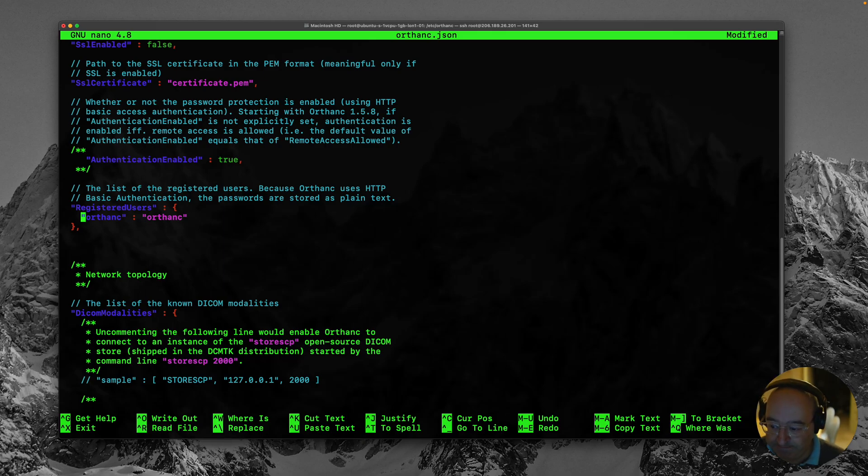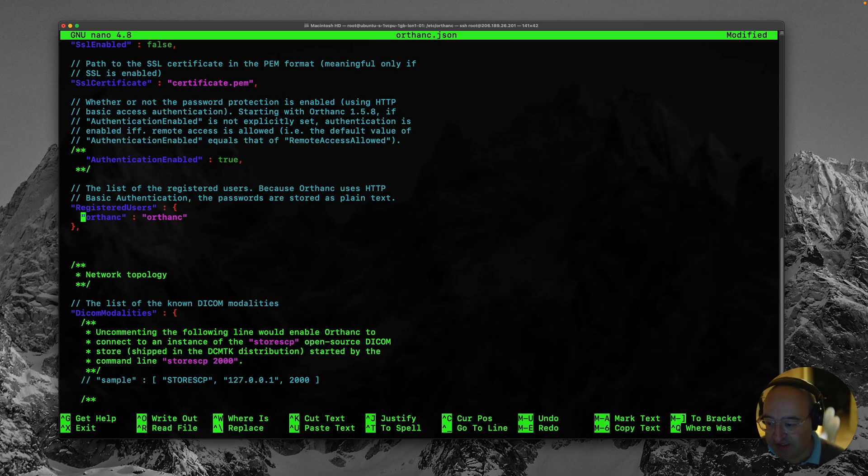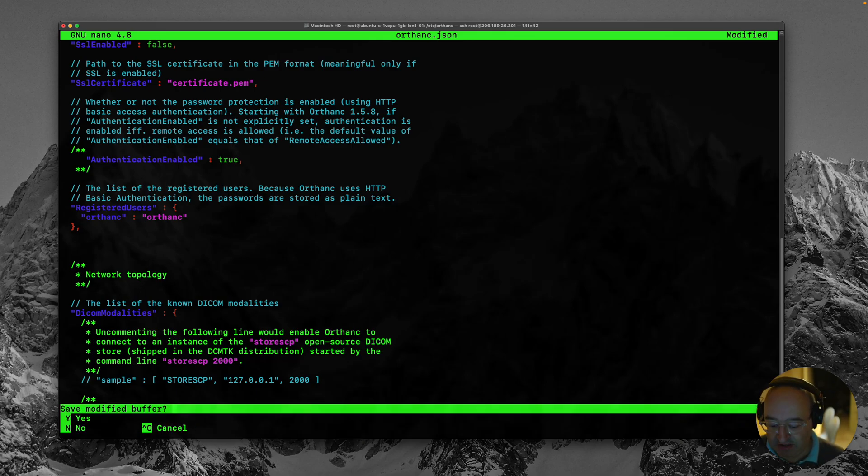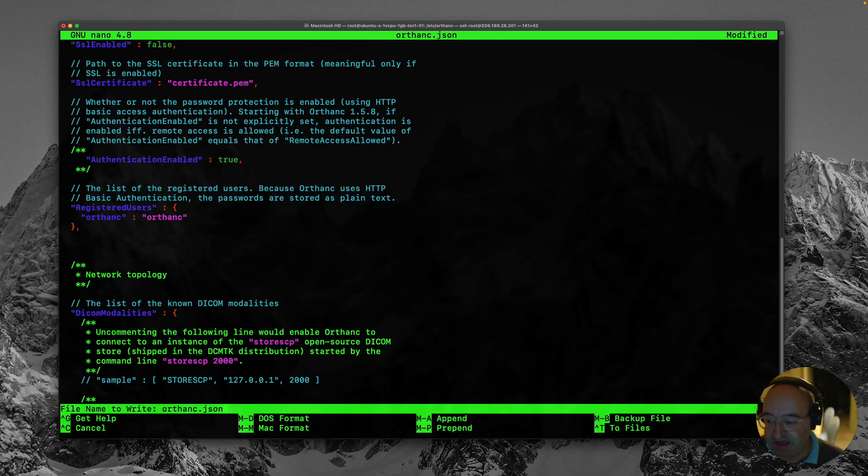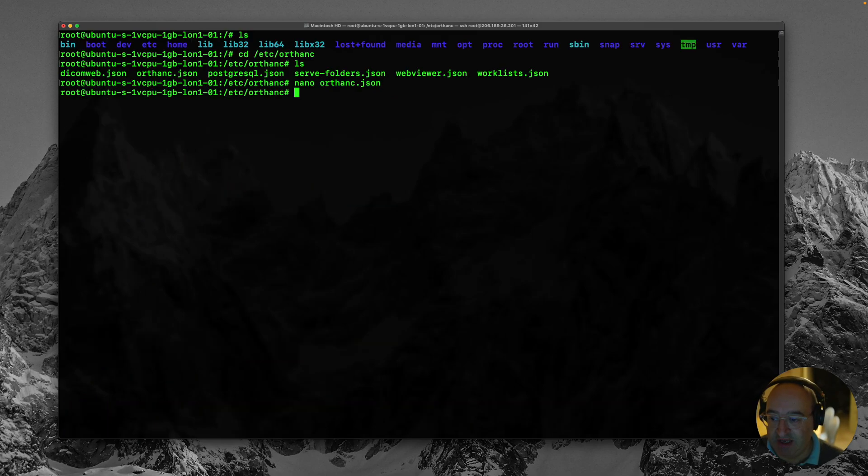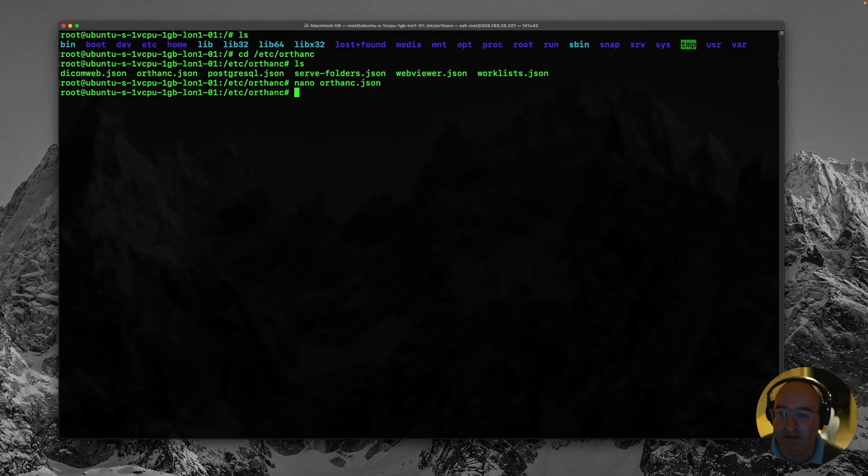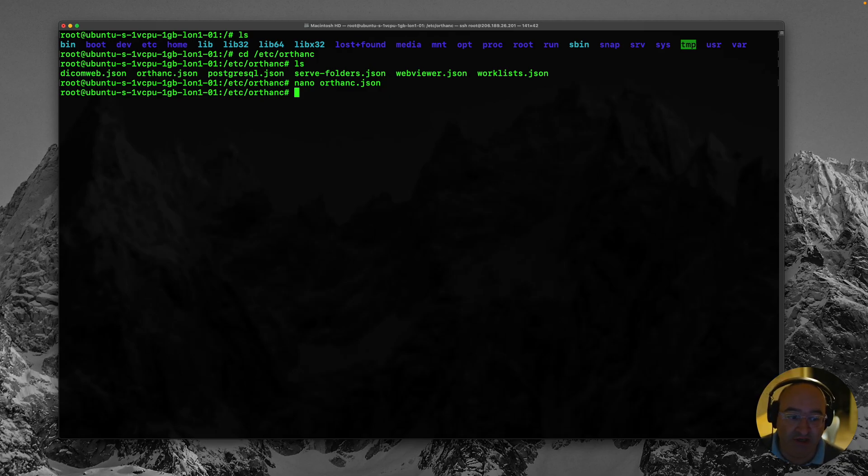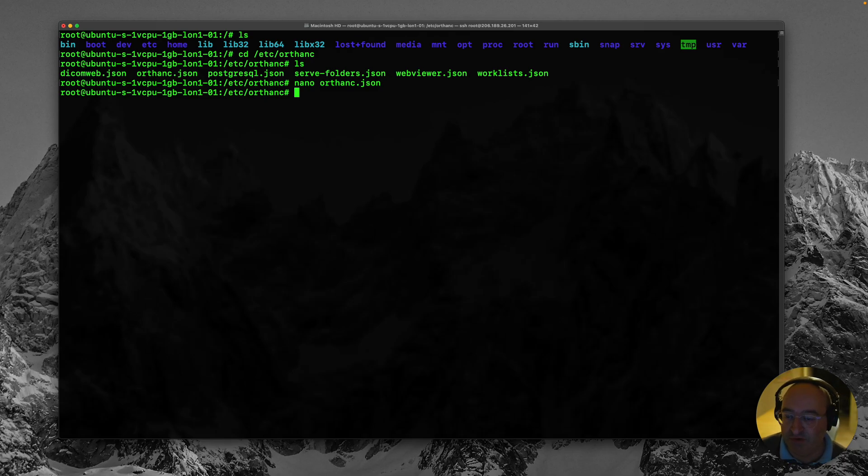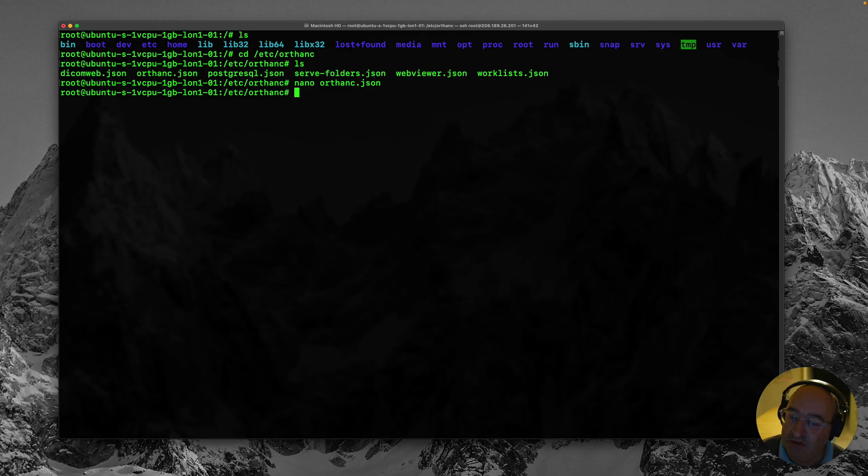I'm now going to hit ctrl x. Which is the exit shortcut. And hit yes y to save the buffer. And then enter. Now you'd think that might just do it. But actually remember Orthanc is a background service which we've got running. So we need to restart the server to recognize the changes we've made.